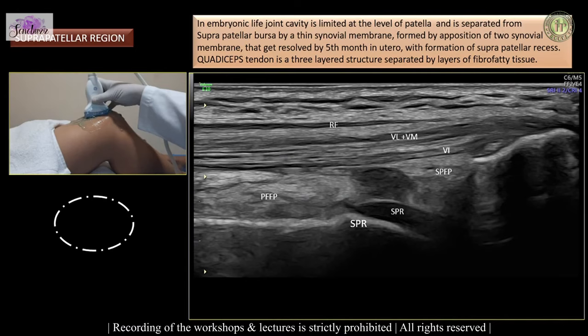In long axis, we can demonstrate the trilaminar structure of the quadriceps tendon nicely. The tendon fibers appear hypoechoic because of their oblique orientation and anisotropy, with intervening hyperechoic loose areolar tissue layers that allow some gliding movement between the tendon fibers.